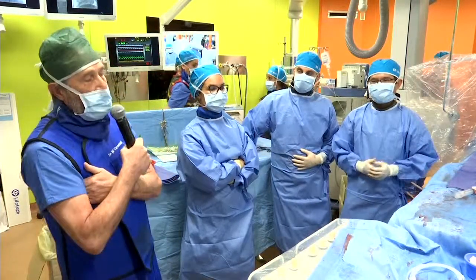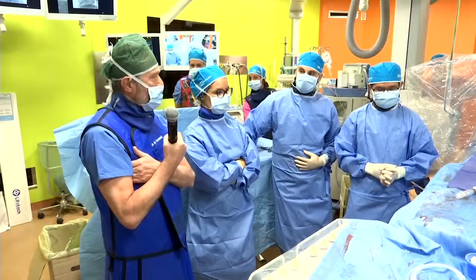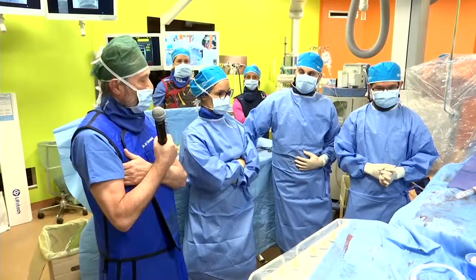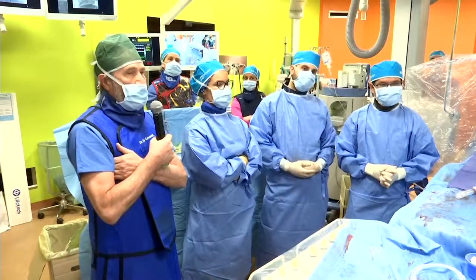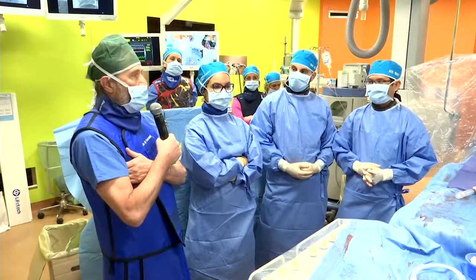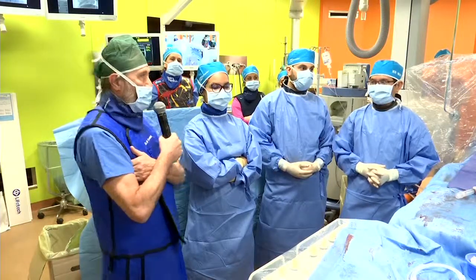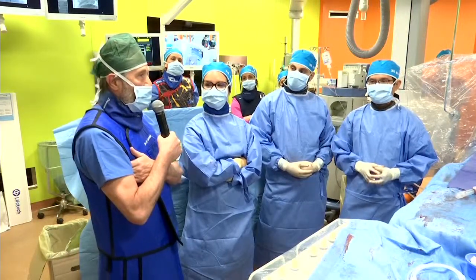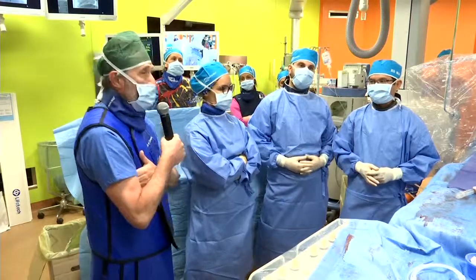So it's likely that the incidence of heart block with the ADO1 device is much, much lower than with the previous asymmetric VSD device, but it still needs to be monitored. Sure. We have to monitor all these patients in long-term follow-up, but we are confident that it will go okay. So I think we started the procedure, and the results are perfect so far.